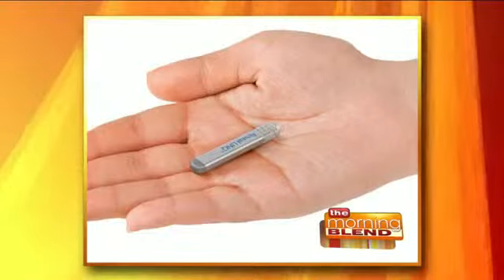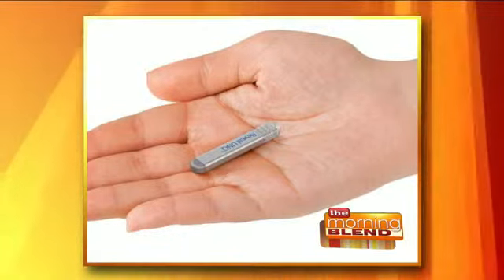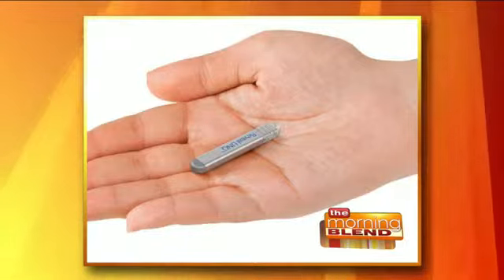So it's not the device itself that changes lives, it's the information you receive from it about the patient's arrhythmia or issue. That's correct. Unfortunately, when patients lose consciousness, it's a very transient episode, because the problem is gone, you have a hard time finding the cause. With conventional testing, only about 10 to 15% of the time can you find the cause, and we spend about $2 billion a year on those tests. But with this device, the diagnostic yield increases significantly.